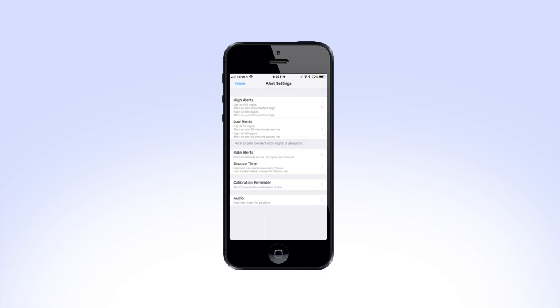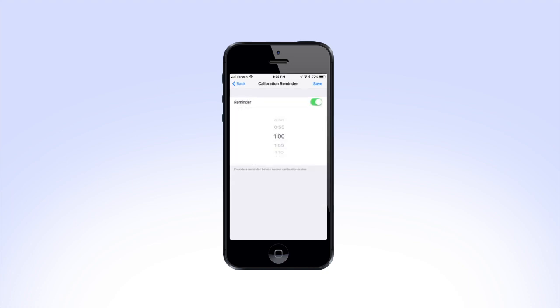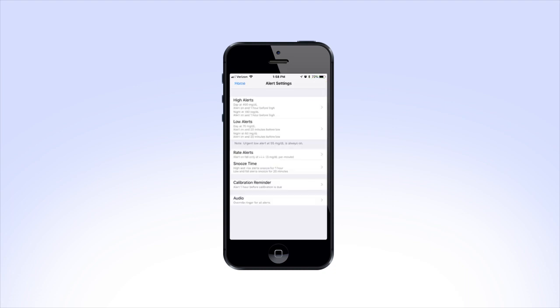Next, tap Calibration Reminder. The Calibration Reminder feature will provide a reminder before sensor calibration is due based on the time that you set. The default Calibration Reminder time is 1 hour. If you decide to change this setting, be sure to tap Save to save your settings.